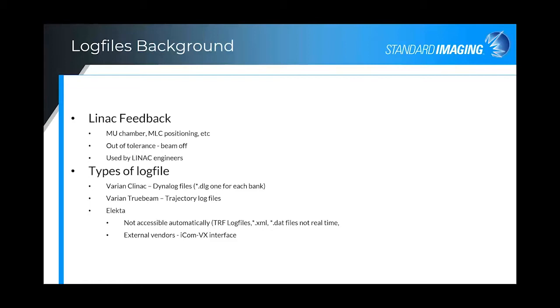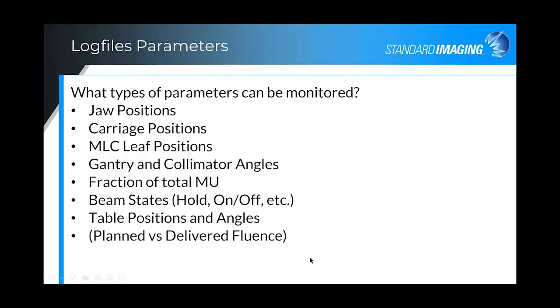The Elekta log files are more complicated. For real-time access, we are required to use their ICOM VX interface to write our own files based on the data stream from ICOM VX. And we do not have access to the TRF log files.